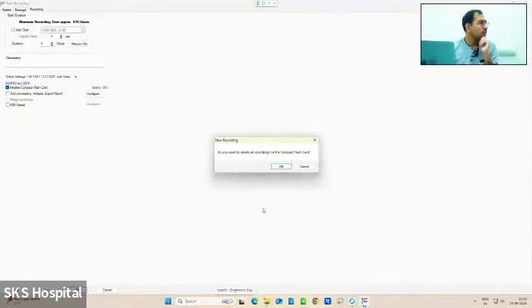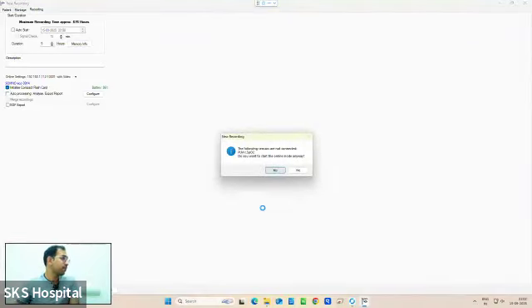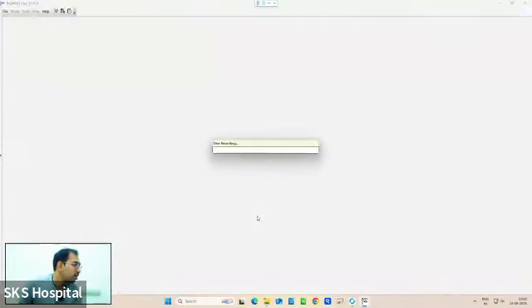So now you can see here, this is a Somnomedics system where you can see that the number of hours of recording are being given and the recording is started. So I'll show you the video of how to connect it tomorrow. So that today we'll straight away start because it is already connected and kept. The patient is also ready to undergo the sleep study.